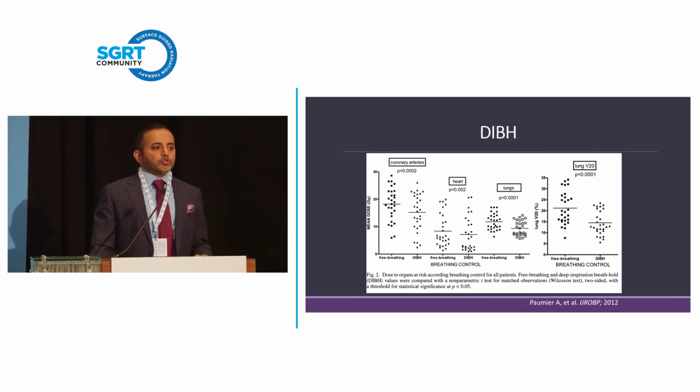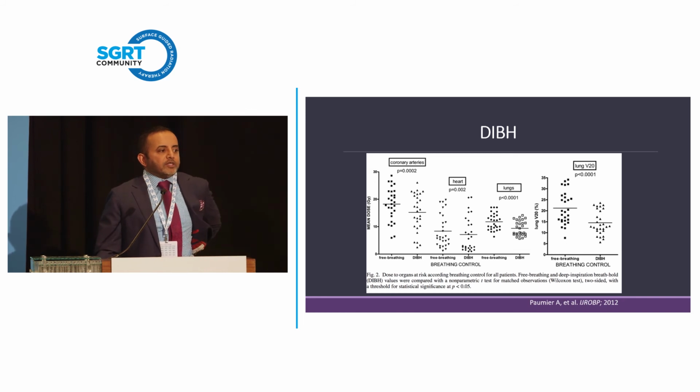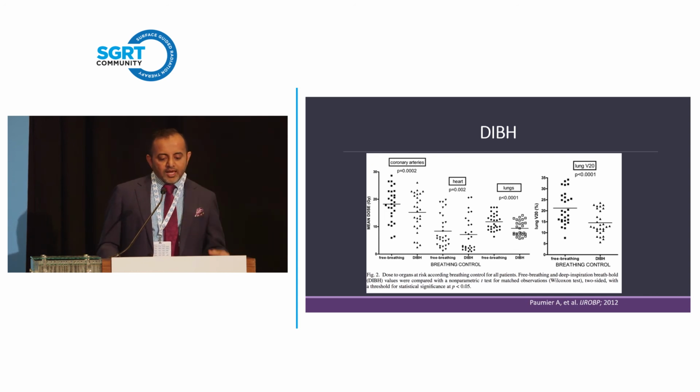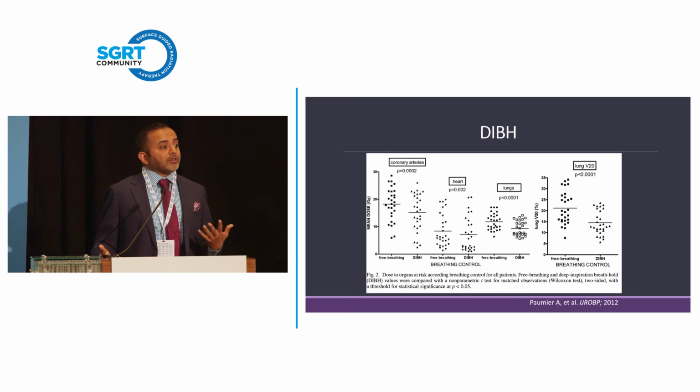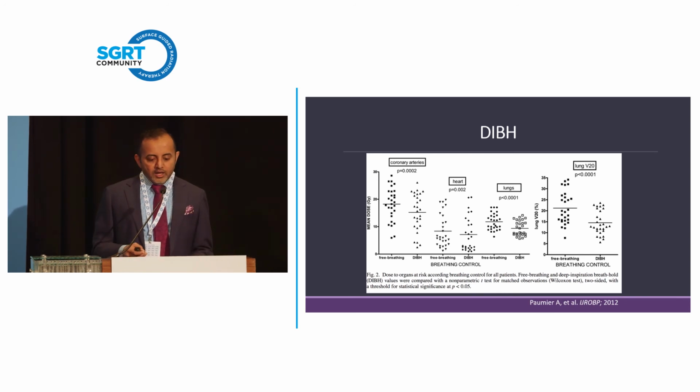So, in the majority of inverse planning lymphoma patients, if you look at a free breathing plan, the mean heart dose is going to be on the order of about 10 to 15 gray, versus if you had done an APPA plan, the mean heart dose was on the order of 15 to 25 gray. When you do DIBH and a VMAT plan for these cases, the goal for mean heart dose should be 5 gray or less. It should be exactly what you do in a left-sided breast cancer patient.